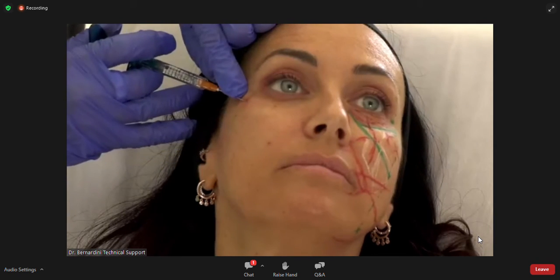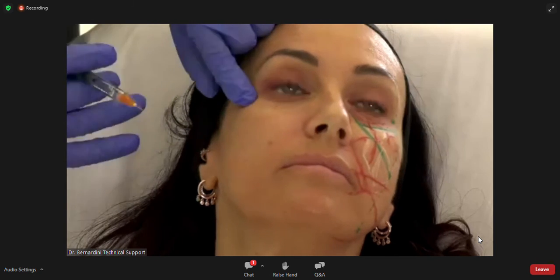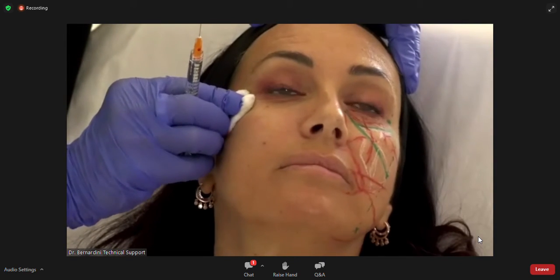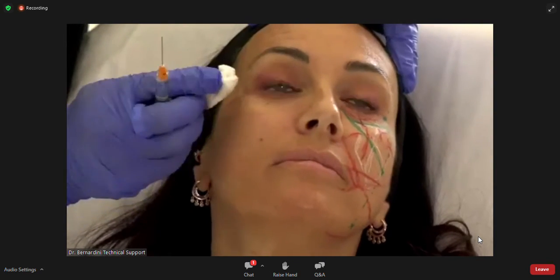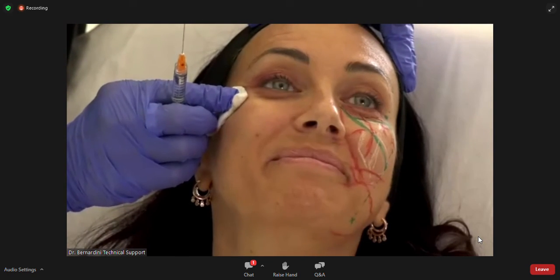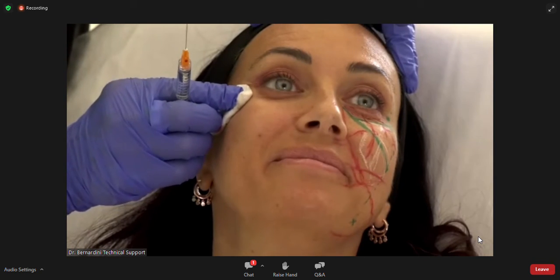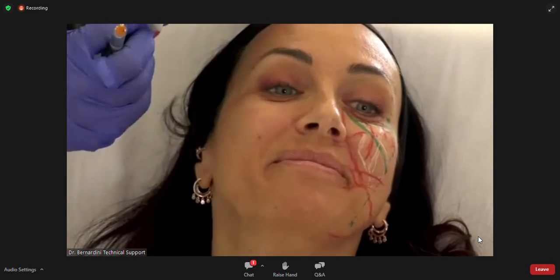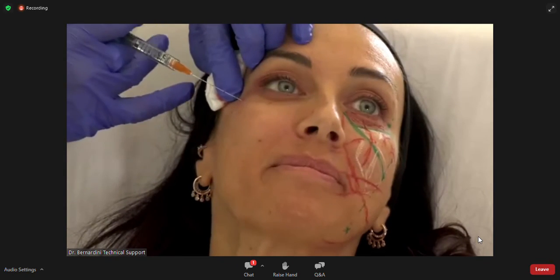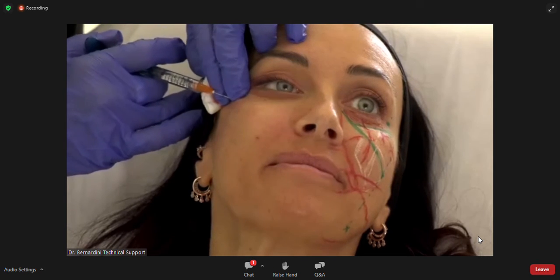And this is the first retrograde injection. Here I'm getting the beginning of ecchymosis. Everything happens today. So that's a little bit to deal with. Too much anatomical explanation to the patient, she can't understand everything, so she's concerned about her muscles, her arteries, and all that. So she's really participating with me in everything that's being done inside.